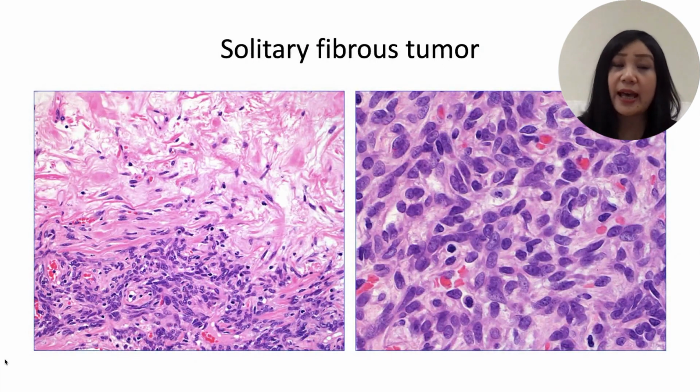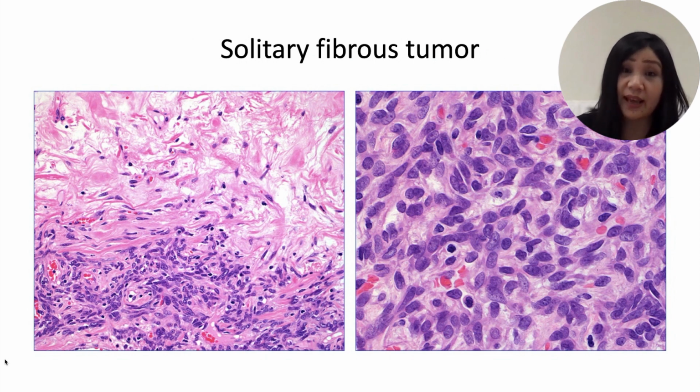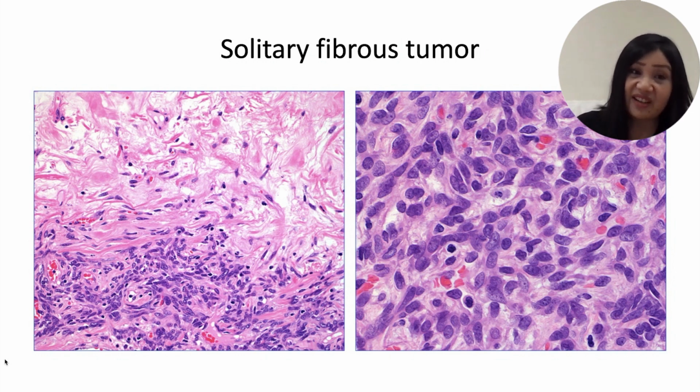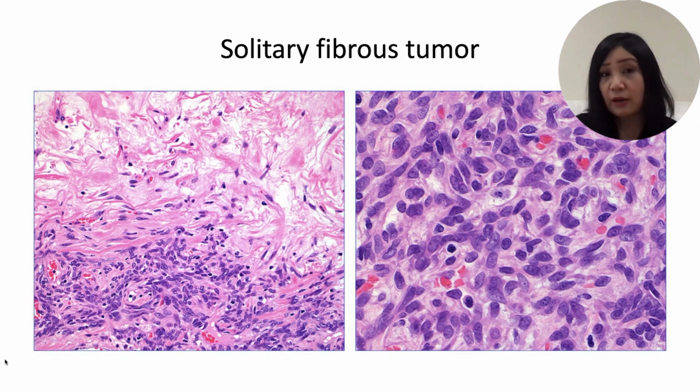Solitary fibrous tumour can, in some instances, be very confusing for spindle cell lipoma, because they are both composed of very bland ovoid to spindle cells and are both strongly positive for CD34. Solitary fibrous tumour typically has the morphology of more hypercellular and more sparsely cellular collagenous areas, containing only small numbers of spindle cells.